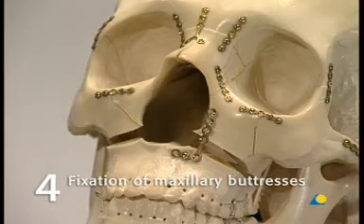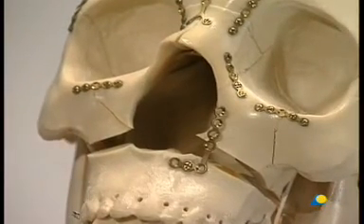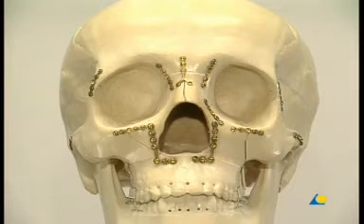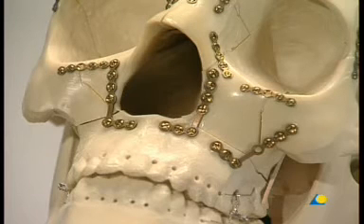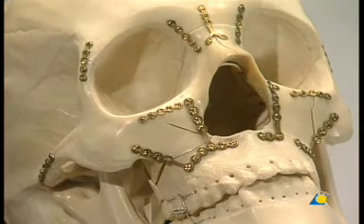Fixation of maxillary buttresses. If the MMF was not applied earlier, it must be applied now. The LeFort 1 fracture is stabilized with 1.5 L plates. The fracture is reduced and fixed with plates along the nasal buttresses. When placing the caudal screws, the tooth roots must be avoided. The fixation is finished with 2 more plates at the zygomatico-maxillary buttresses. The bone here is considerably stronger than it is over the maxillary sinus.